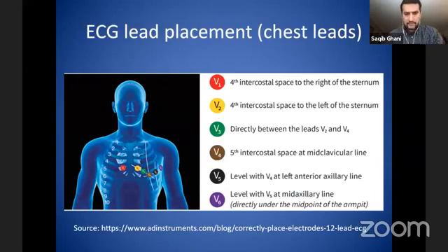So other important thing is where to put the ECG leads. अब depending on आप कहाँ काम कर रहे हैं, which sector, कहीं डॉक्टर ECG करते हैं, कहीं नर्सेज ECG करती हैं, कहीं टेक्नीशियंस करते हैं. बट आई थिंक इट्स इम्पोर्टेंट सबको पता हो कि ECG लीड्स लगानी कहाँ होती हैं. I don't know if someone is doing psychiatry here. UK में अगर आप psychiatry कर रहे हैं तो nurses को allow ही नहीं करते patients ECG लगाना, डॉक्टर्स खुद कर रहे होते हैं ECGs.